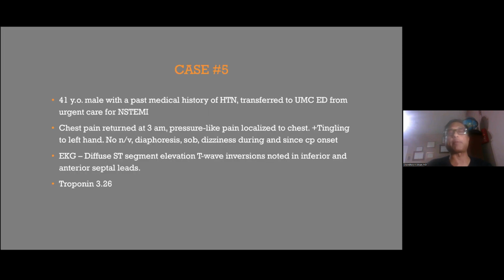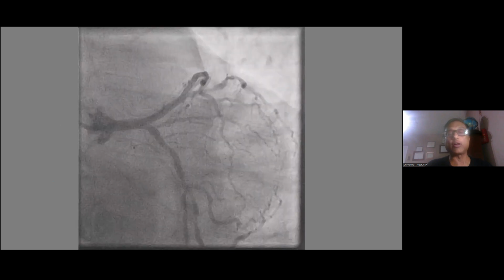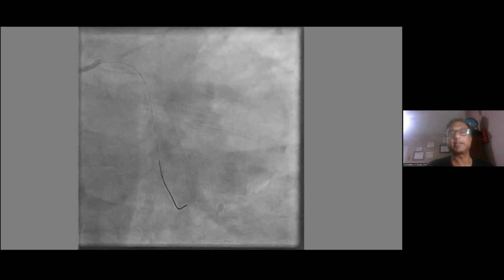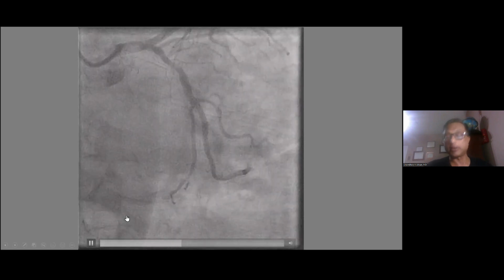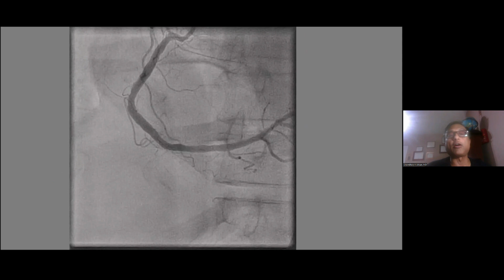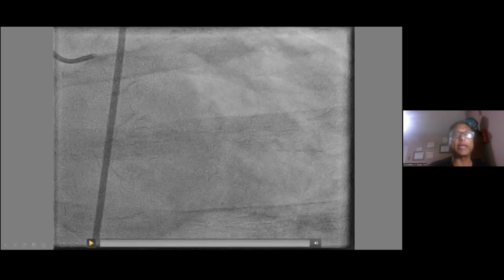So when we talk about this kind of lesions, we always wonder about trifurcating lesions. And I am very comfortable now using multiple flow wires, and using that as a guidance for determining which one we should do and which one we should leave alone. But things may not be that easy all the time, because patients may come in a different way.